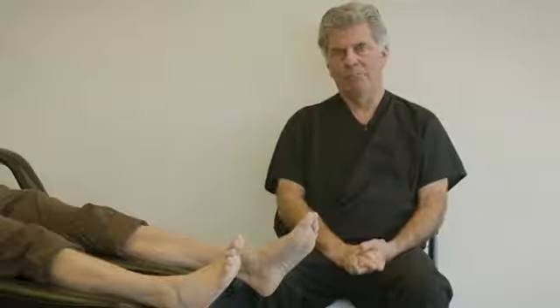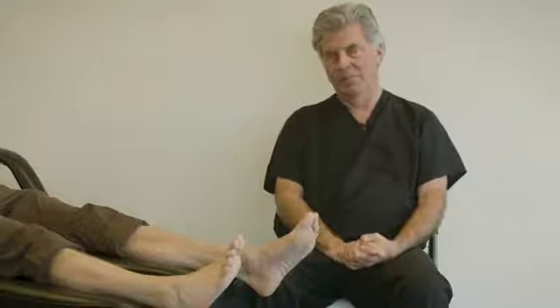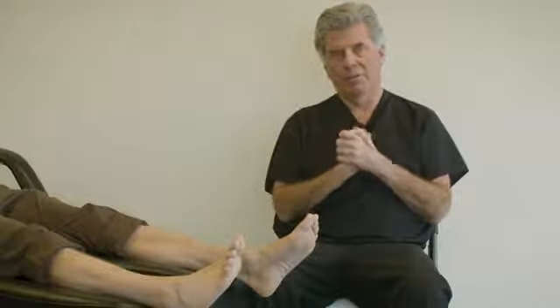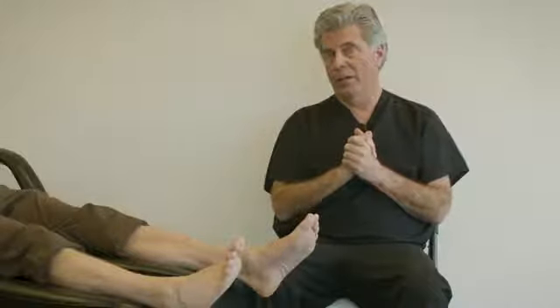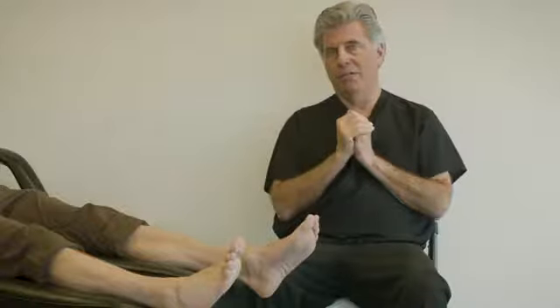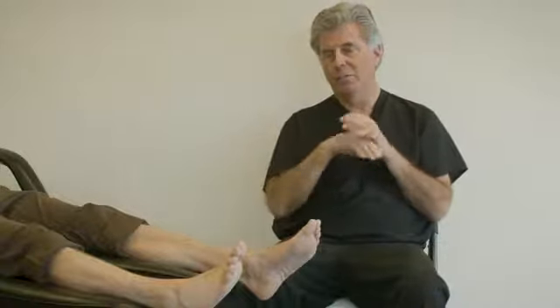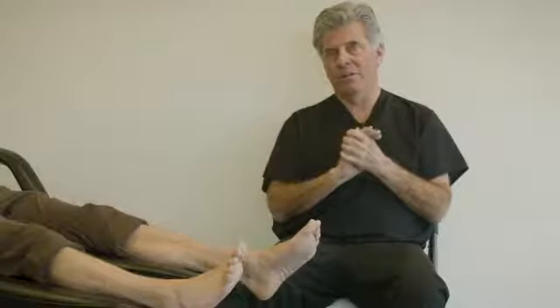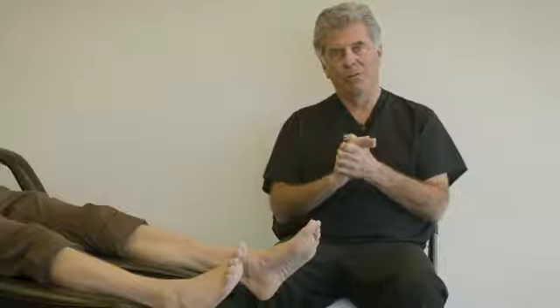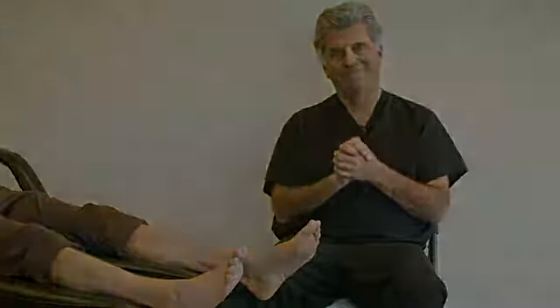One challenge practitioners face on a daily basis in their clinical setting is explaining foot orthotic therapy to patients. Trying to explain the difference between a true functional foot orthotic versus something they can buy off the shelf in the pharmacy. I learned early on in my career that demonstrating the motion of the foot and the deformity of the foot using the patient's own foot as a live model was a very effective educational tool. And I'd like to take you through that with this simple little demonstration.